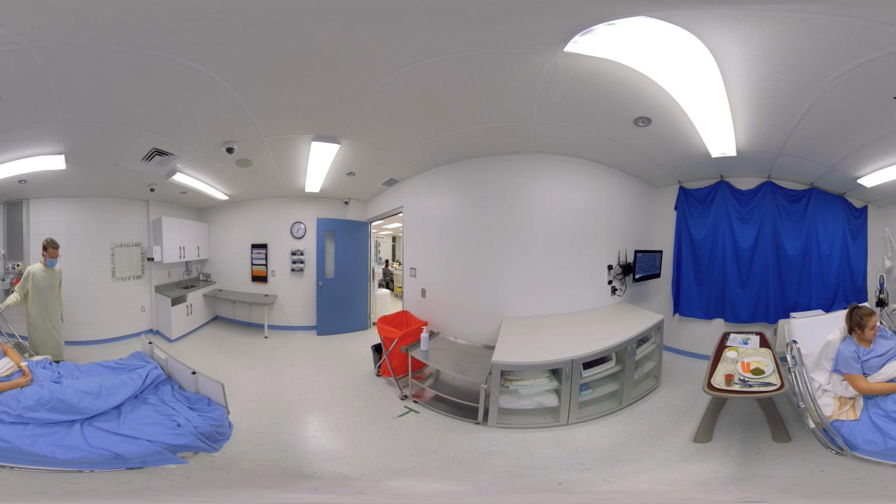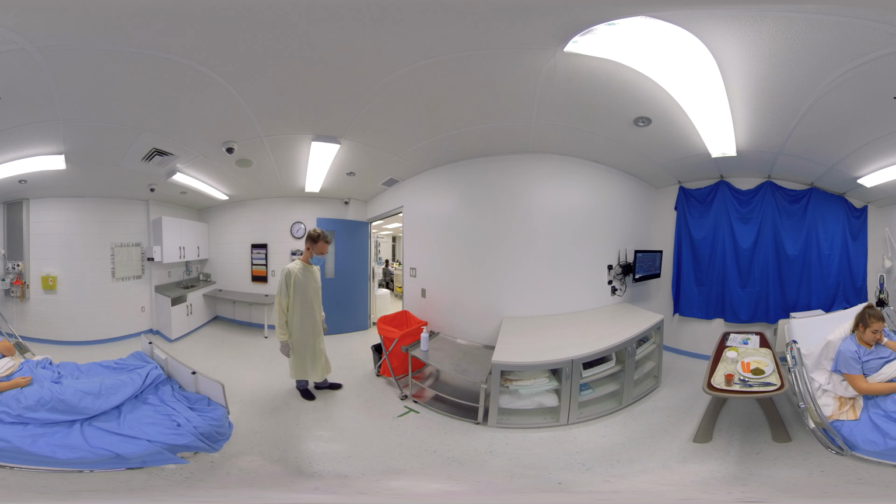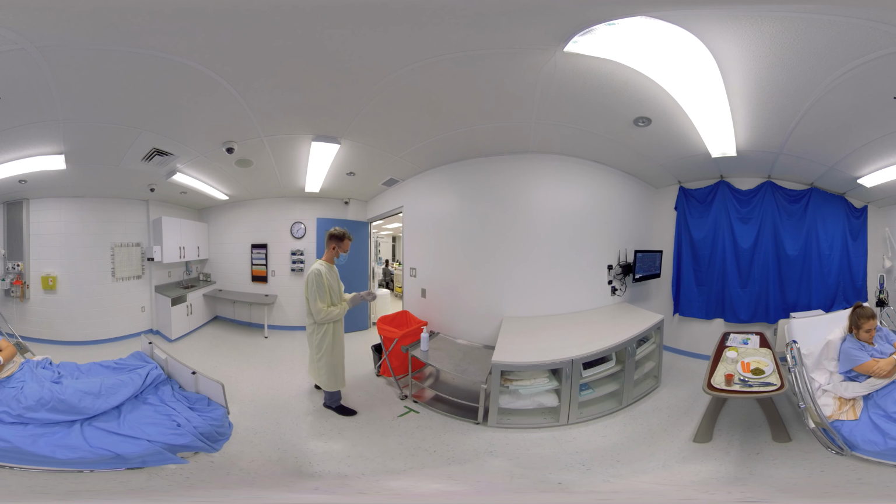Informing the client about the time the nurse will come back and that she can ring at any moment for assistance will help her feel better and less lonely. The nurse must follow a specific personal protection equipment removal sequence in order to avoid contaminating himself. To take off the first glove, the nurse grasps the exterior edge and peels it down to turn it inside out.